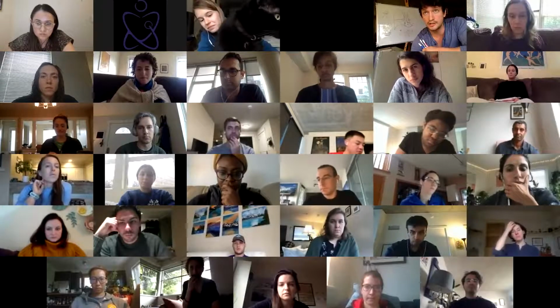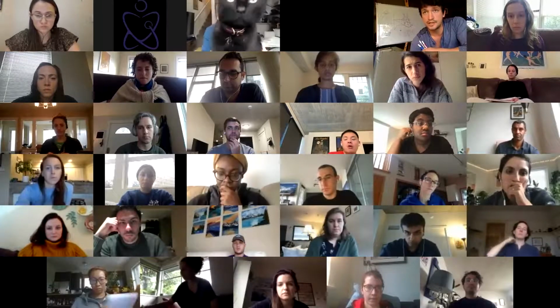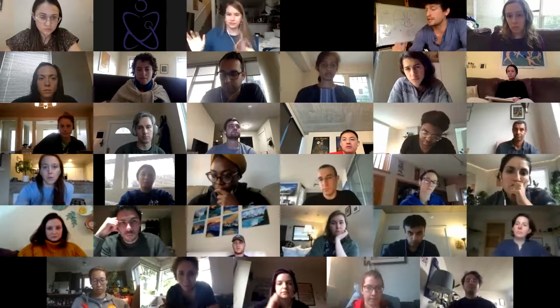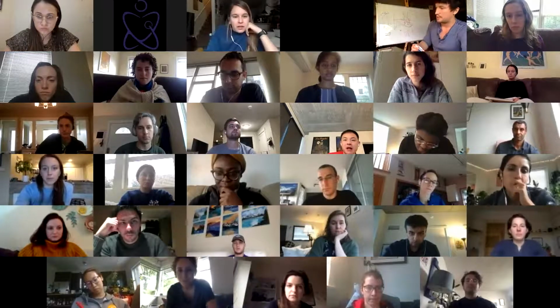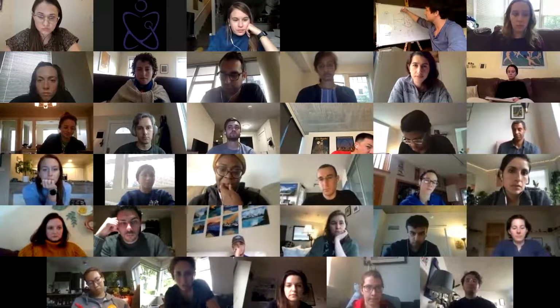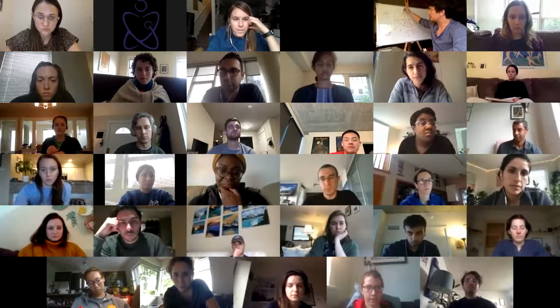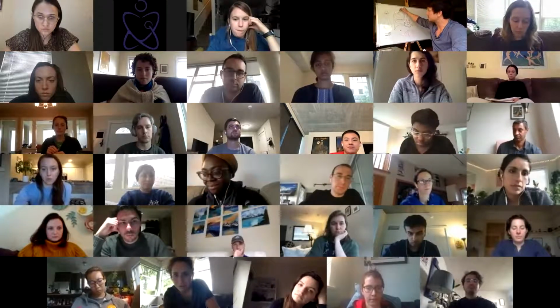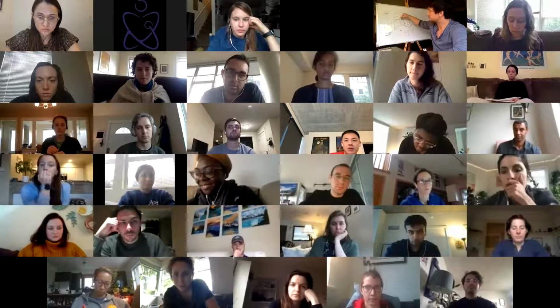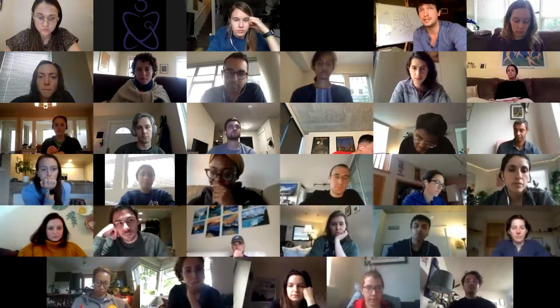The other letter in the DOCTORS ABCDE is RIPE. And that acronym just looks for rotation, looks for inspiration. You should have about 6 anterior ribs, which are going to run like this. So you want 6 on a good film, and then about 9 posterior ribs. These are going to run this way, going down.